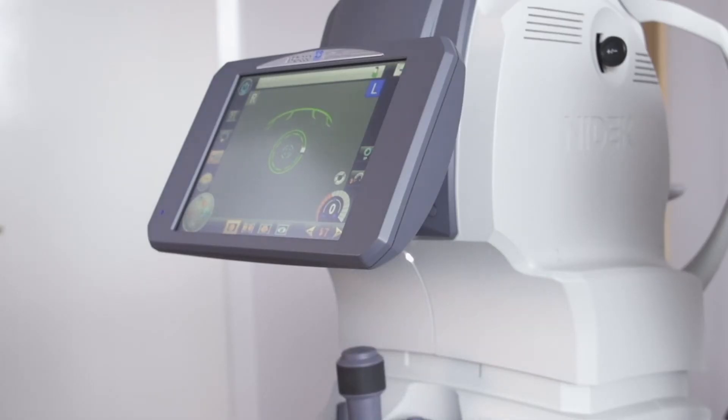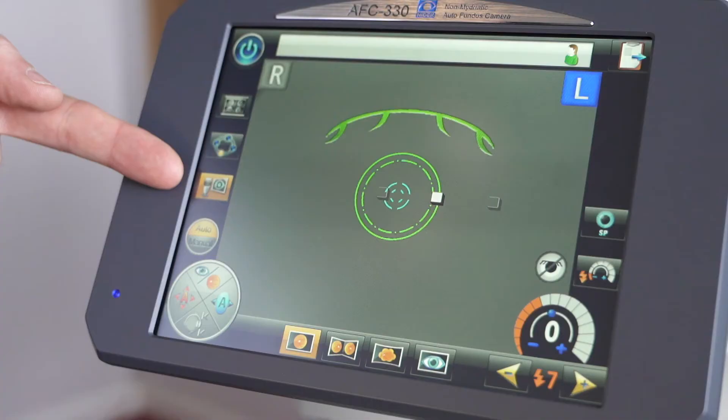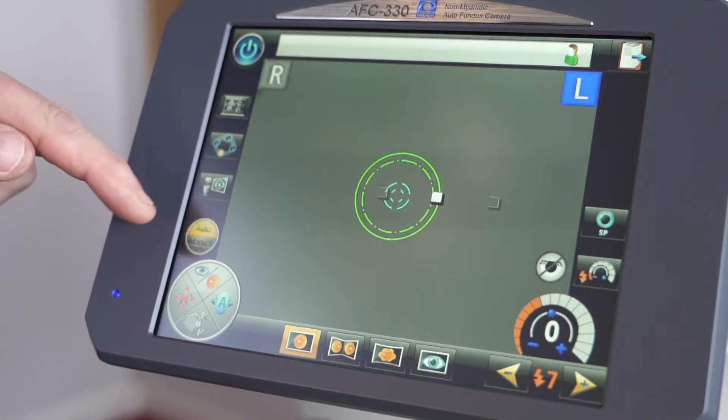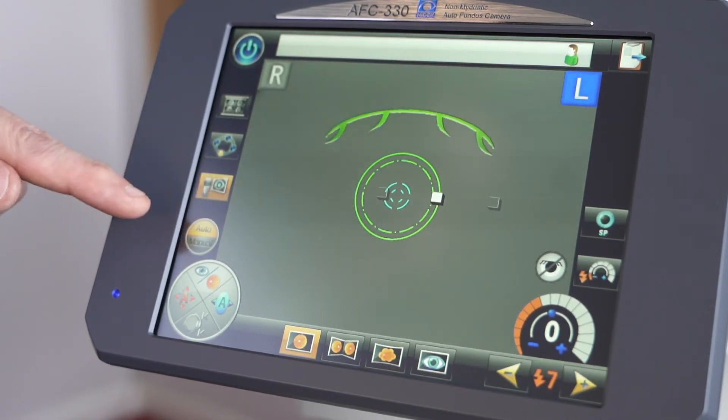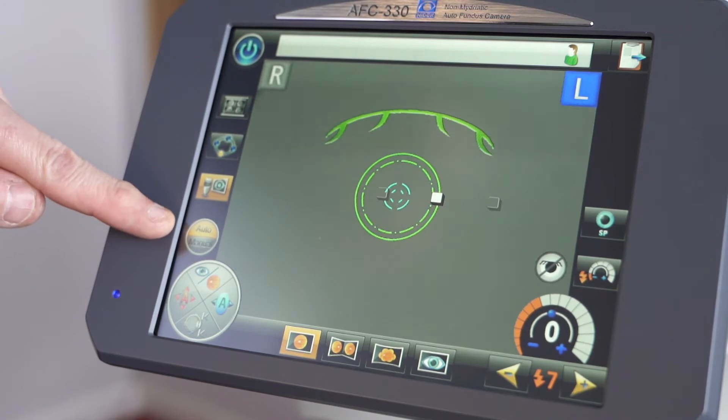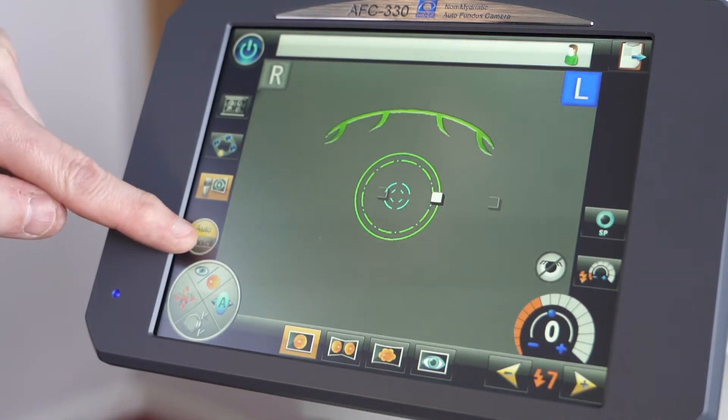As you see, the screen at the moment is the main default start position for the AFC330. To run through the icons, here we have the off switch which is used to power it down once you are finished with the device. This icon here turns on and off the auto capture option.